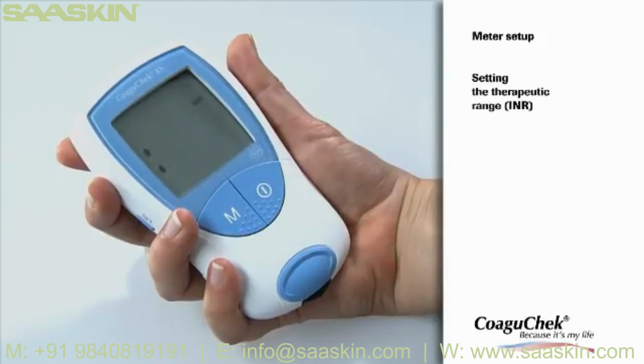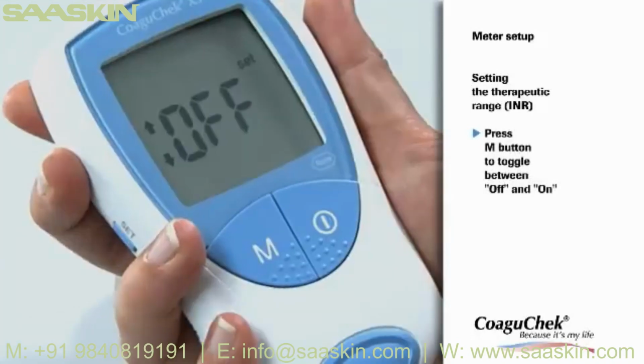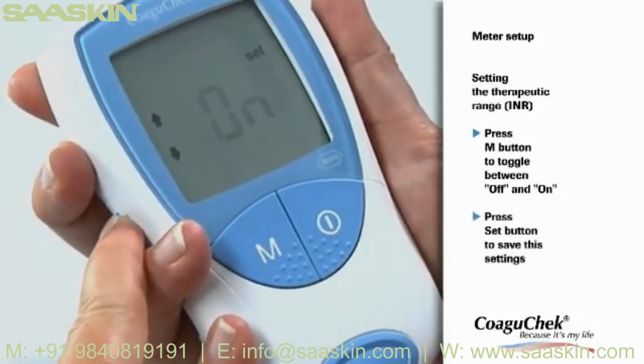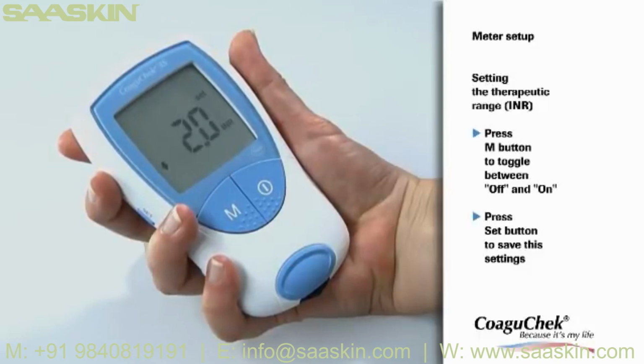If you have selected the unit INR, you can now choose whether you want an additional element to be displayed. This shows if the result is above or below your therapeutic target range. First, press the M button to toggle between off and on, and once again press the Set button to save your setting. If you have decided to use this function, you are now able to enter the limits of your target range.